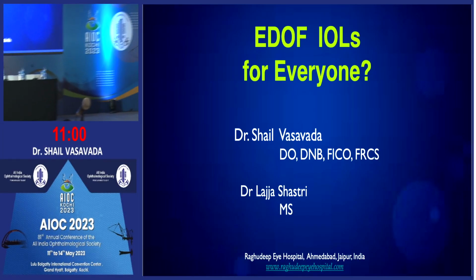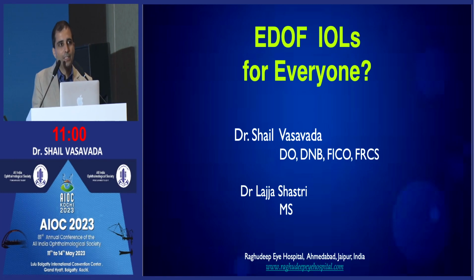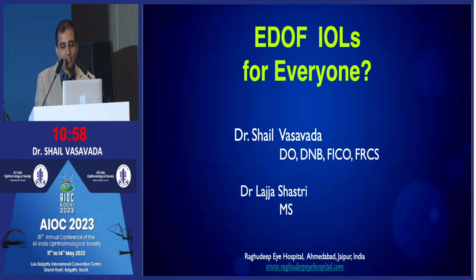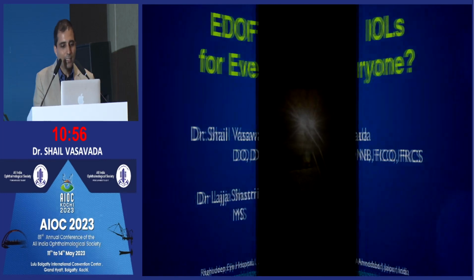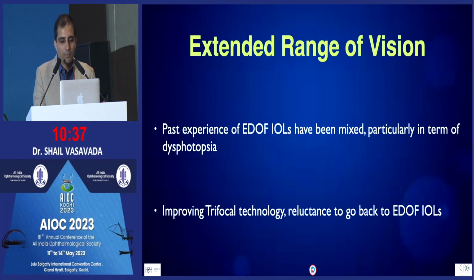An excellent talk by Dr. Sharma, who has laid the ground very nicely for the different varieties of IOLs and the different patients we can choose for each of them. I think the number one reason why surgeons hesitate to implant multifocal IOLs is that they don't want the headache post-operatively, that the patient may come with complaints of photic phenomenon, complaints of poor quality or waxy fluctuating vision, and that's probably the major hesitation that all of us have had.